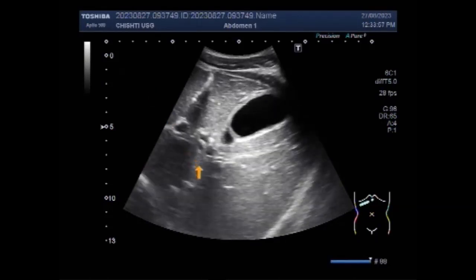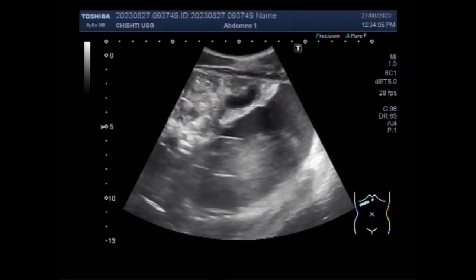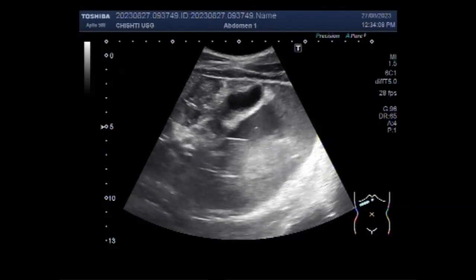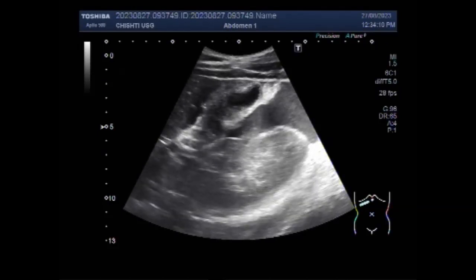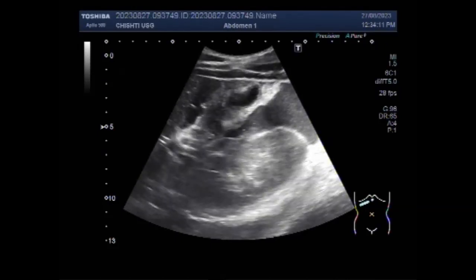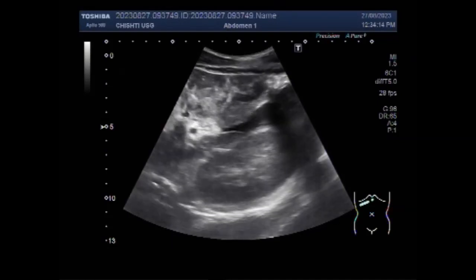You can see the liver and gallbladder. Intestinal perforation, defined as loss of continuity of bowel wall, is a potentially devastating complication that may result from a variety of disease processes.